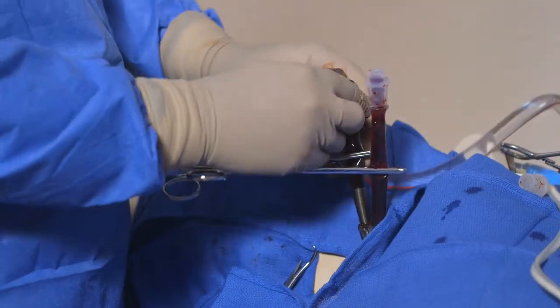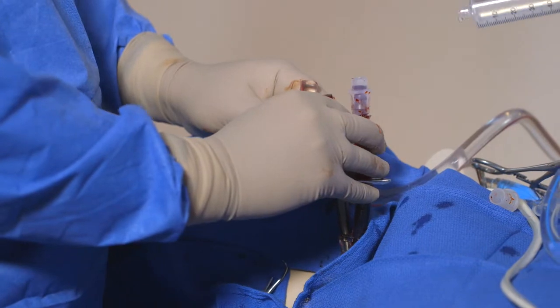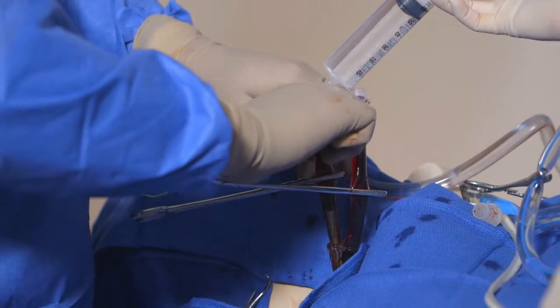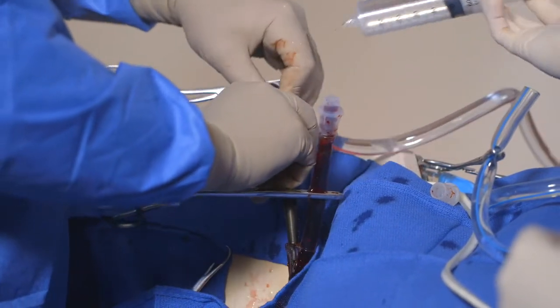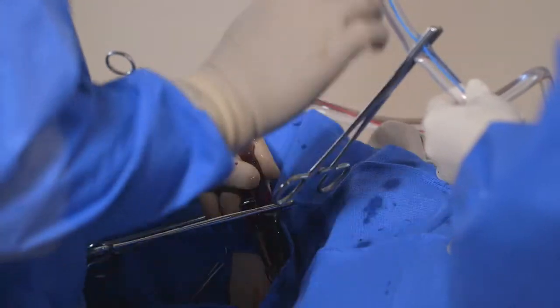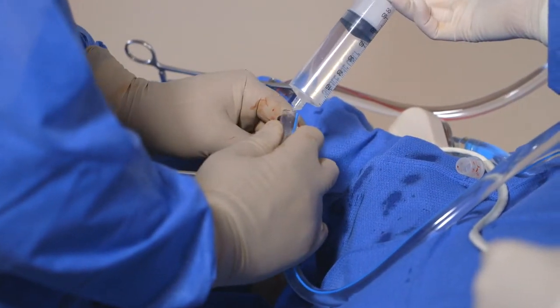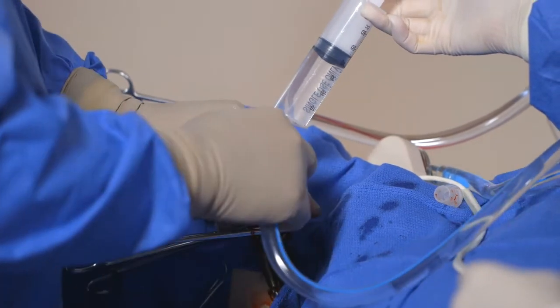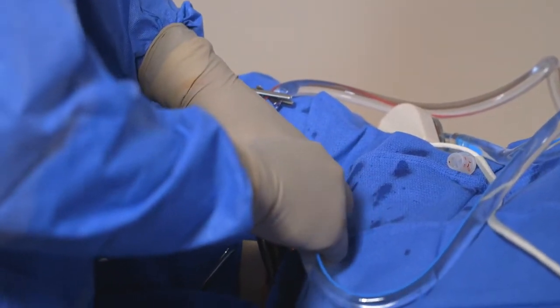Pump connection to the cannulas can now be performed. Connect the pump outflow tubing, marked with a red stripe, to the cannula port you wish to return blood to, using a wet-to-wet connection. Next, connect the pump inflow tubing, marked with the blue stripe, to the cannula port you wish to drain blood from, using a wet-to-wet connection.